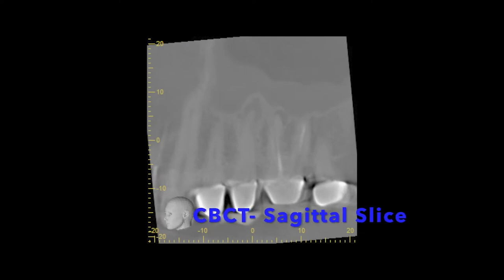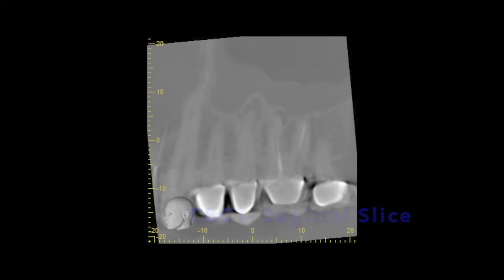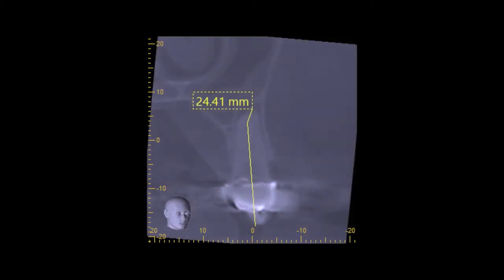Looking at the CBCT, you can see a lesion on number 14 at the mesial buccal root, and on number 13. So we've got to retreat 14, which we did later. The 13 is our focus. You can tell from the coronal slice there's only one canal on 13, so this is a perfect case if you're new to the game.